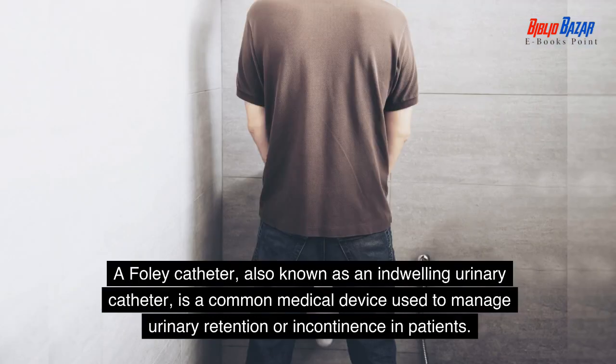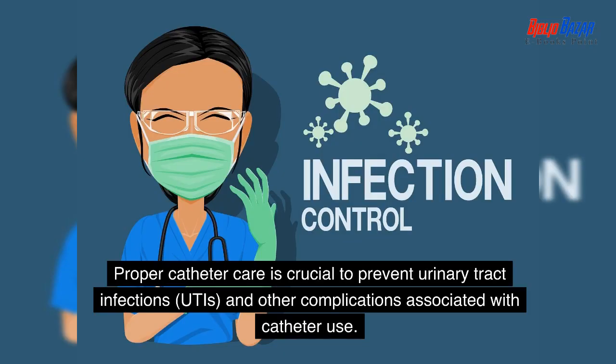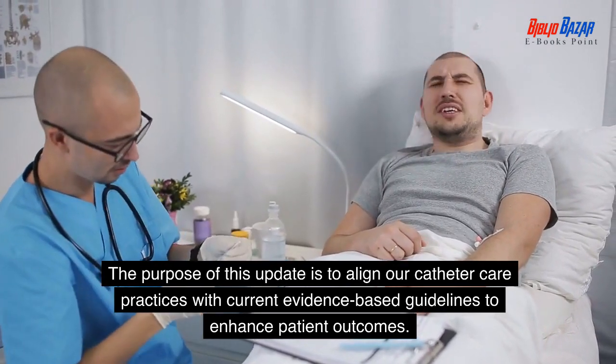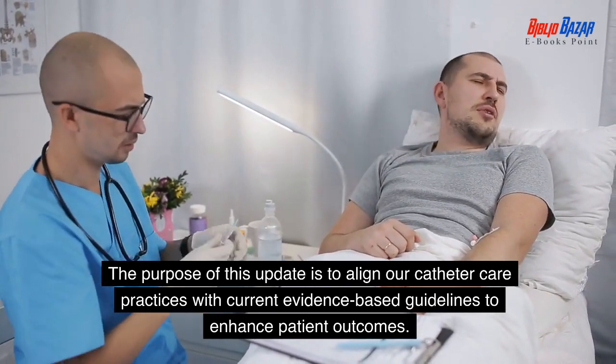A Foley catheter, also known as an indwelling urinary catheter, is a common medical device used to manage urinary retention or incontinence in patients. Proper catheter care is crucial to prevent urinary tract infections, UTIs, and other complications associated with catheter use. The purpose of this update is to align our catheter care practices with current evidence-based guidelines to enhance patient outcomes.